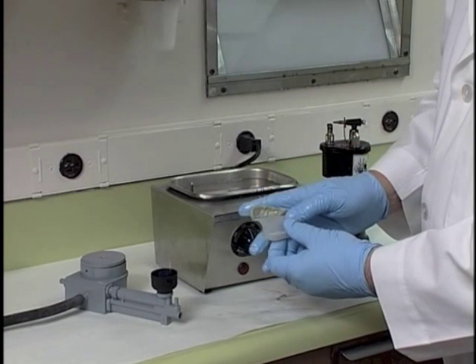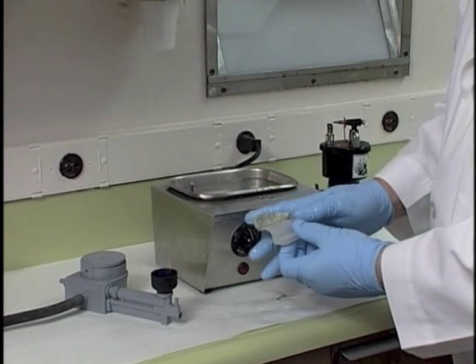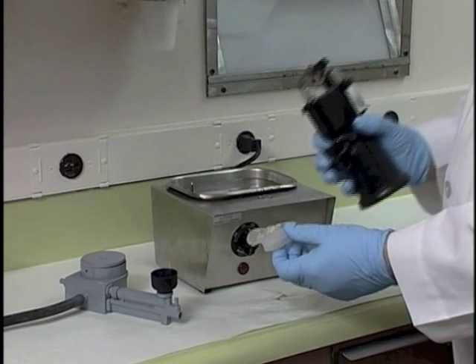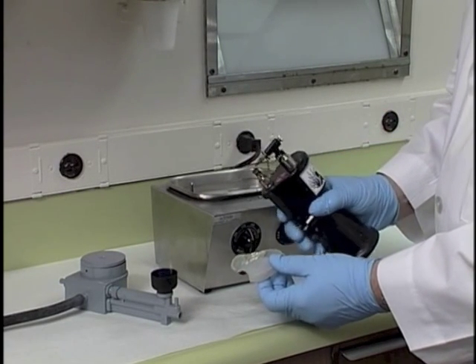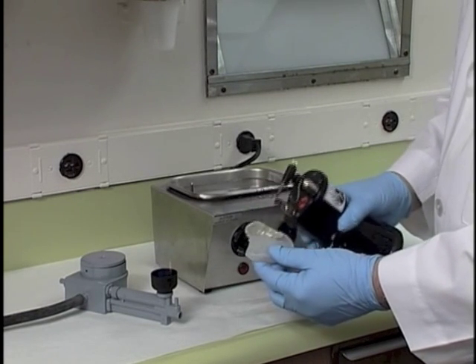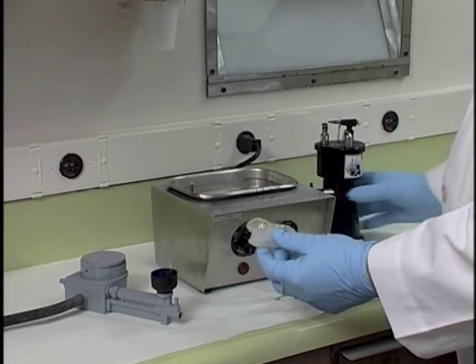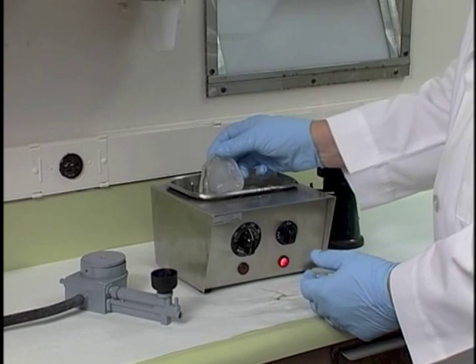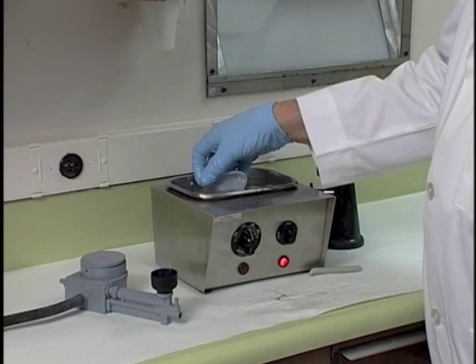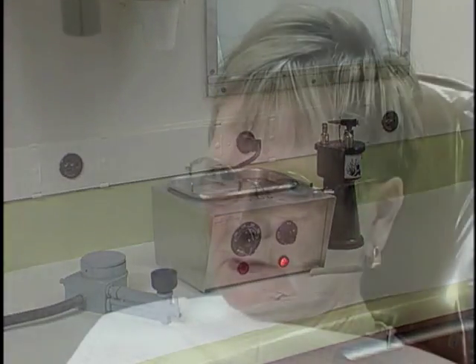And so we form it like that after wetting the fingers so that we can form the material. Once we've wet the fingers and formed the material up like that and built it up in that fashion, then we're going to take our Hanau torch and soften this material once again to make sure it is nice and soft. Now remember that the material is super hot on the surface. So we're going to temper the material for about 3 to 5 seconds in the water bath, and then from there we will be going to the patient's mouth.